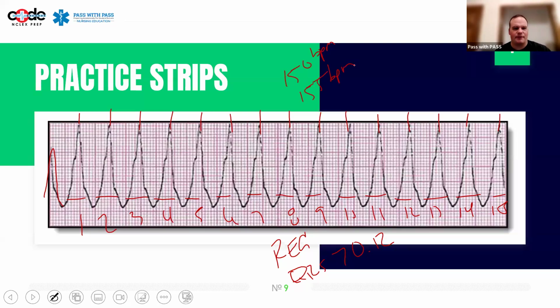But some instructors, if they see a QRS complex that is cut off like right in the middle, they'll say add 5 for that instead of adding 10. Hopefully that makes sense to you all. So this is 150 or higher. So it's wide complex, it's regular, it's greater than 150.